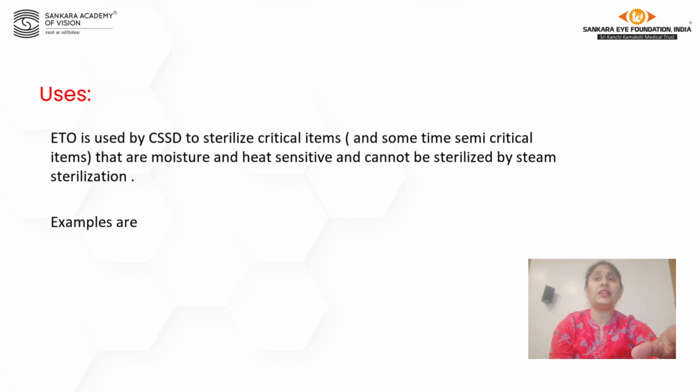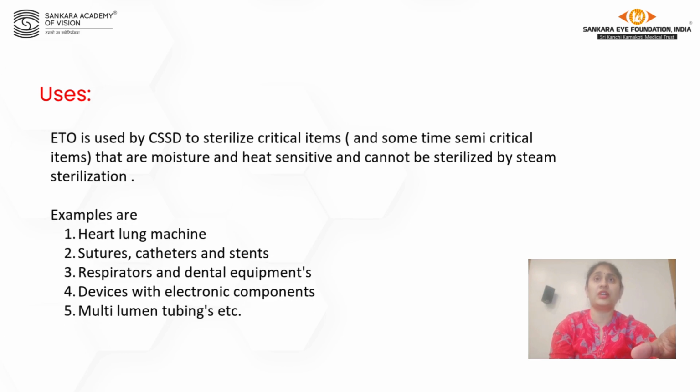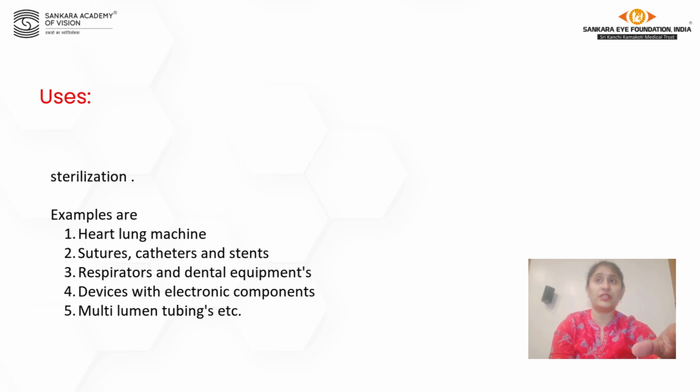It is mainly used for critical items and also sometimes to sterilize semi-critical items. For example, heart-lung machines, sutures, catheters, stents, respirators, dental equipment, devices with electronic components, multi-lumen tubings, etc.